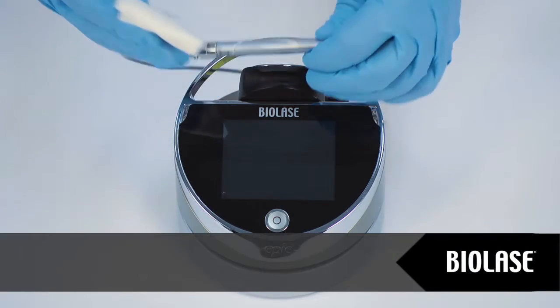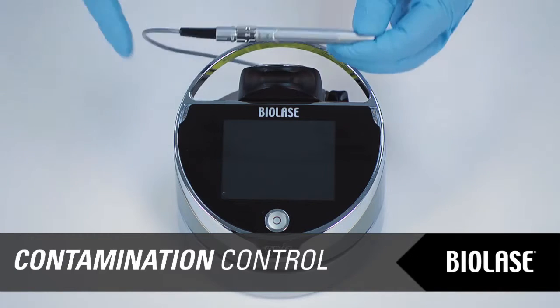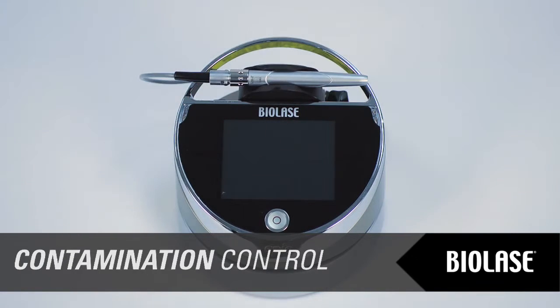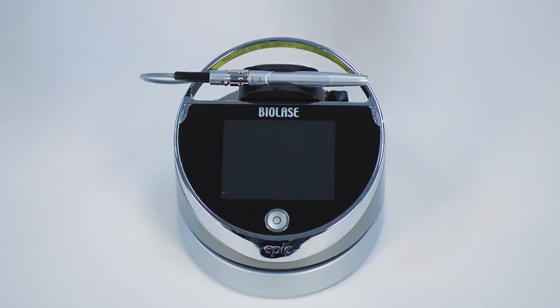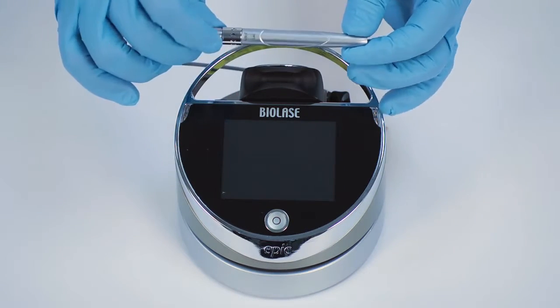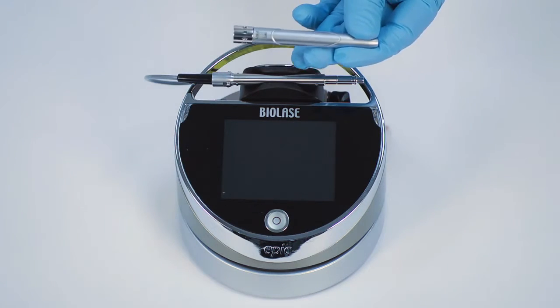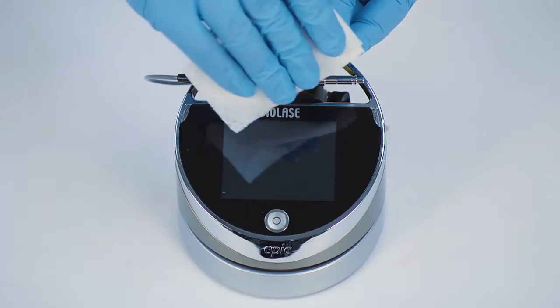The contamination control suggested for the Epic surgical handpiece and tips is the steam sterilization method. However, before sterilization, the Epic reusable handpiece should be carefully cleaned per the procedure that is outlined in the Epic user manual in Section 8. Please read that section of the manual carefully prior to performing contamination control procedures.